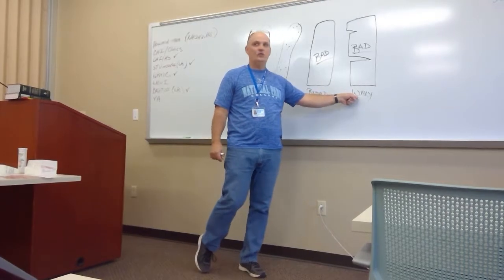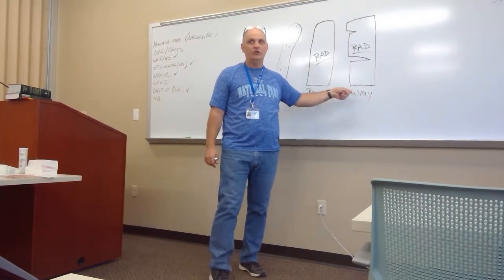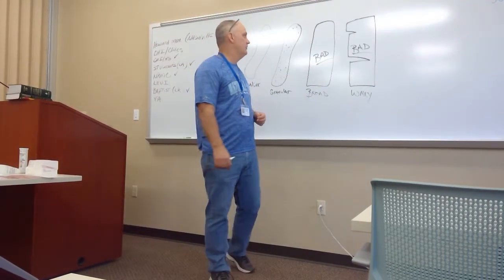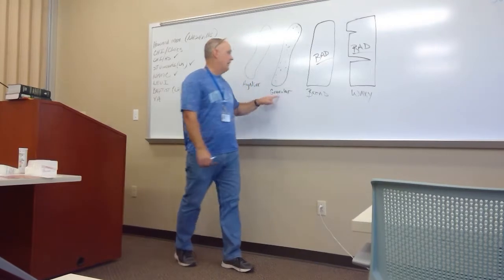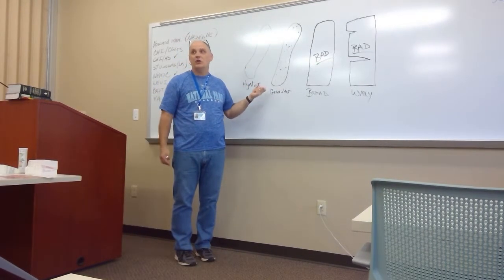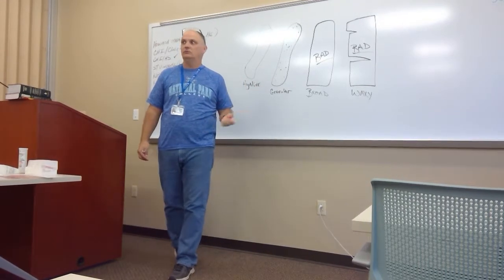I have never seen one of these, ever, okay? But if you do see one, it's not good. It's usually somebody that has severe kidney trouble. Most of the time you see them in books. I've seen a lot of these granular casts. You'll see those, and they even break it down. You have what's called finely granular cast and coarsely granular cast.